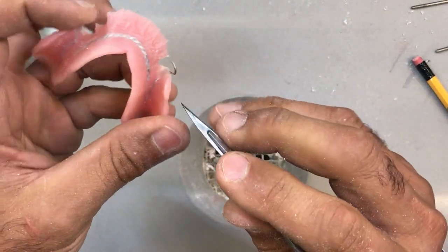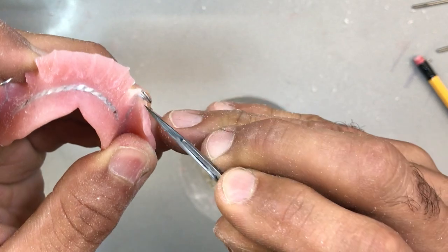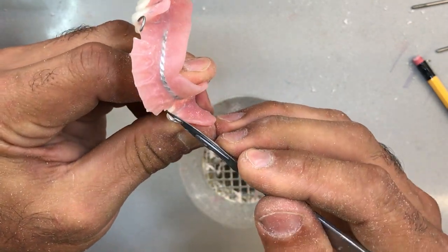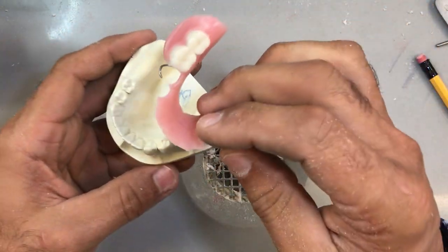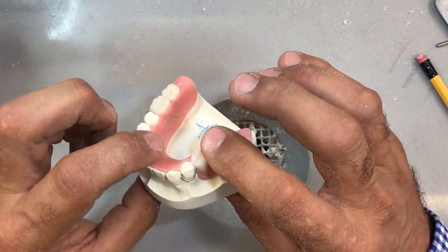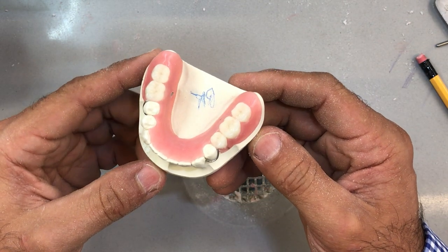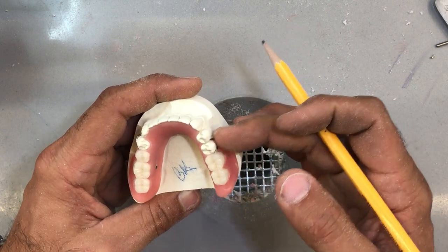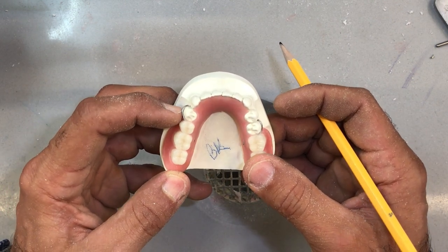Just with a sharp scalpel — same thing on the other side. Let's see how this fits now. The only thing that's going to retain this is the retention from the clasps — nothing else. And that looks pretty nice. There's no space between the apron all around the partial. The clasps should be engaging as they were before — if not, maybe this one here is not, because I might have stretched it out while taking it apart. So I'm going to just go back and bend it back in.